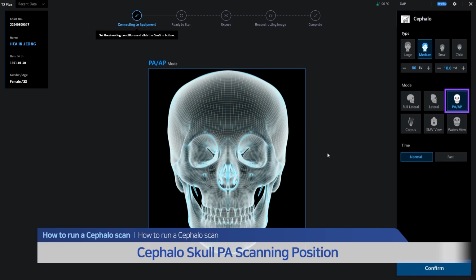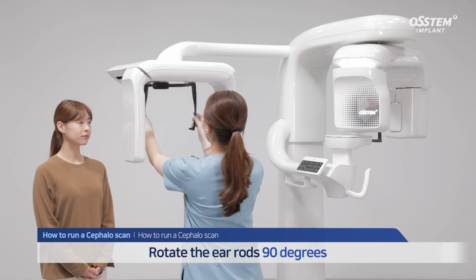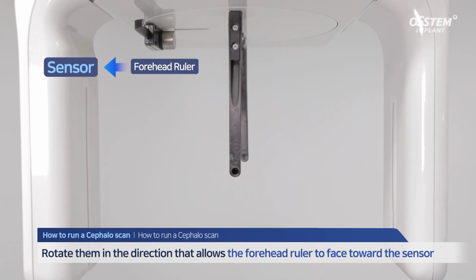Now, let's take a look at the cephalo PA scanning position. Hold the ear rods and rotate them 90 degrees. Rotate them in the direction that allows the forehead ruler to face toward the sensor. Raise the forehead ruler upwards.